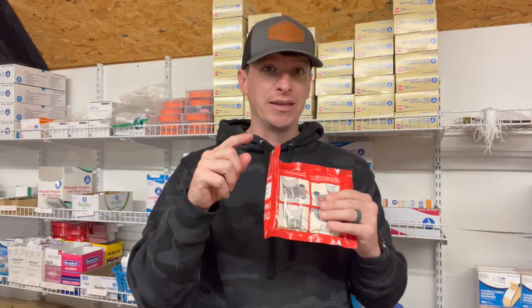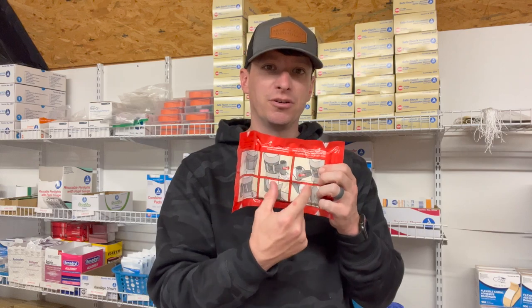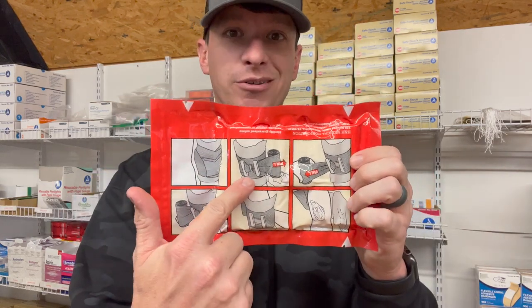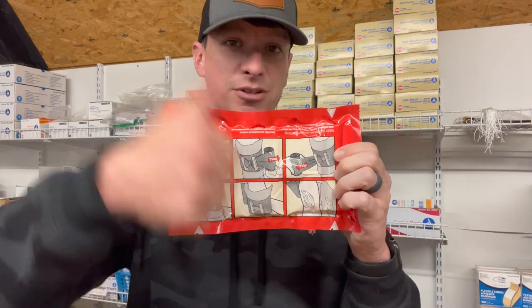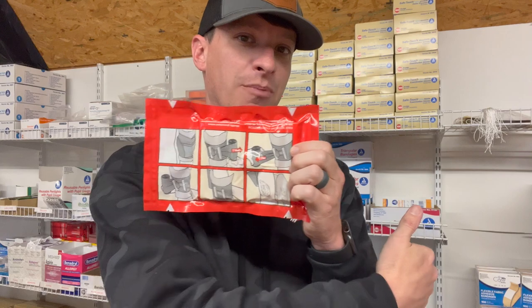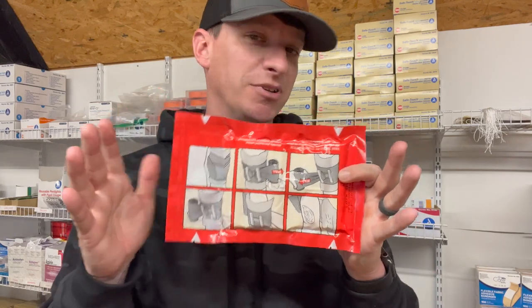It's an H bandage, so it's got a little pressure bar on the middle of it. I'll see if I can see it on camera. The pressure bar there looks like an H. So when you run it across, you hook it back in, you pull it across, come back to the other side, hook it through the H and pull it back across. Simply how it's done.